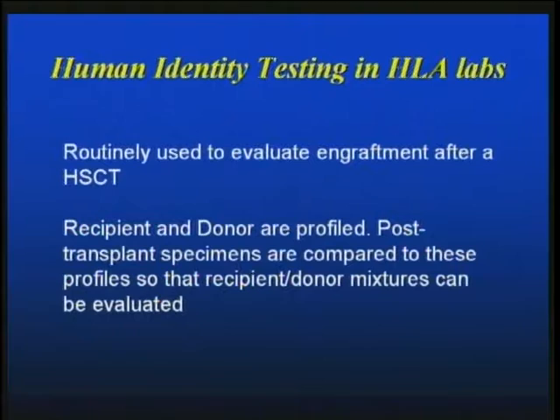So when it comes to human identity testing in DNA in HLA labs, what we do is a little more prosaic than what I just described to you, though no less important, I believe. It's routinely used for engraftment monitoring after a human stem cell transplantation. And the basic course of events is that the pre-transplant DNA from the recipient and donor DNA is collected and profiled. And then post-transplant specimens are compared to this profile in order to determine if there's a mix or if there's entirely 100% donor or 100% recipient in a post-transplant sample.